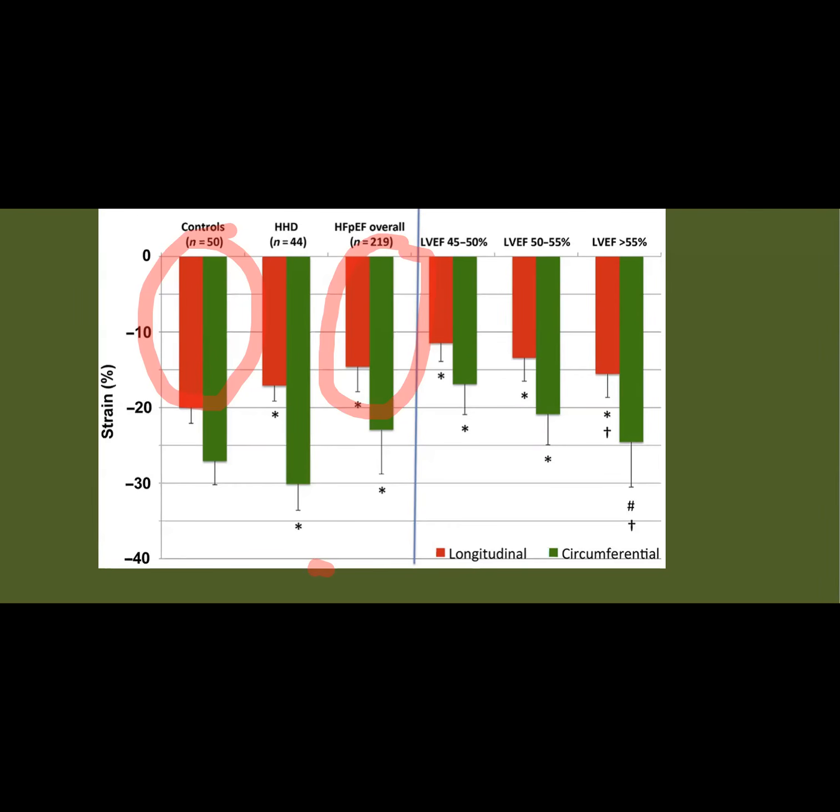Okay? So you see the complexity that strain brings will change many concepts, because the things we used to look at, with our fallback or background analysis based on the ejection fraction, are now based on a better way, which is strain and strain rate. Now this tells us a different story. You know, what we thought about HFpEF is not as we used to think. HFpEF had reduced systolic function. So things can change. Okay.